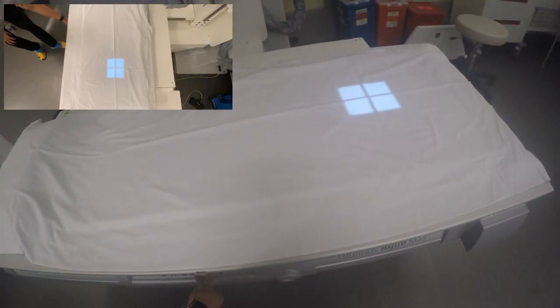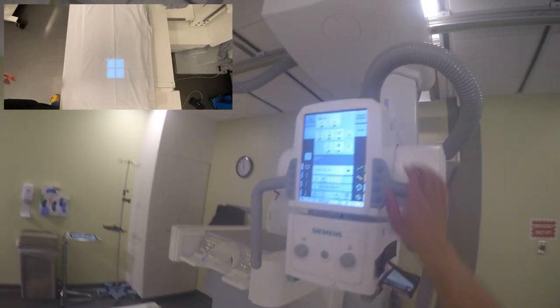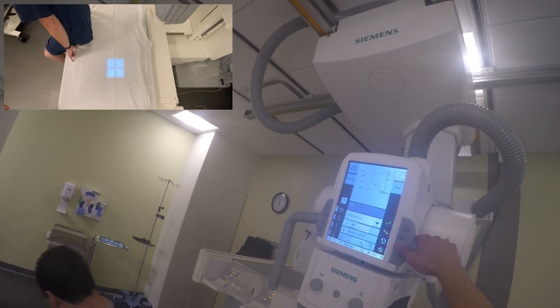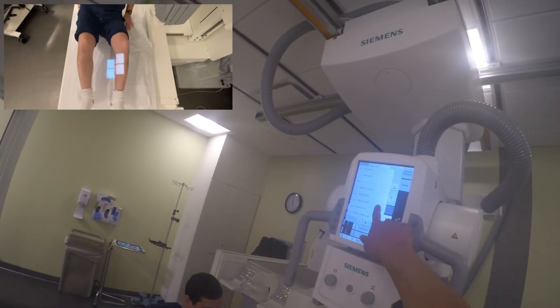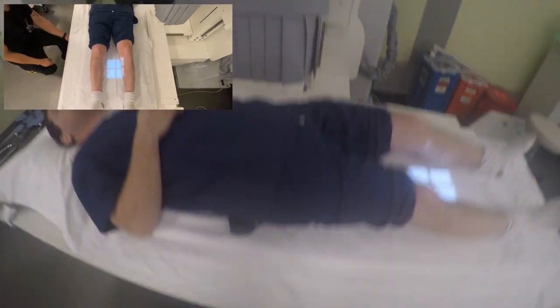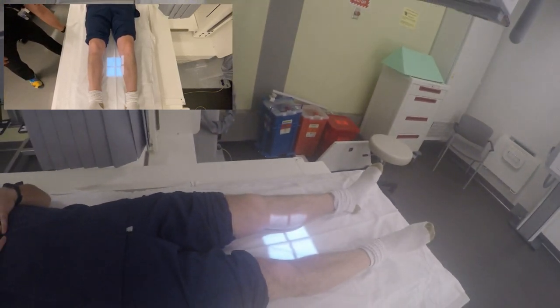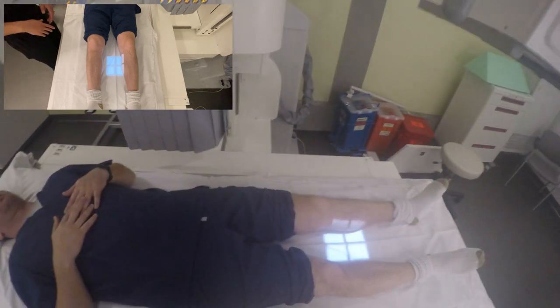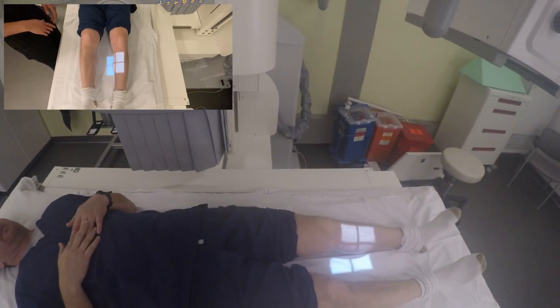Let's go ahead and have you on your back here, please — head on the pillow. We're going to start off with your left knee. I'm going to lift the table up here, okay — just don't be alarmed. Slide over towards me just a little bit. Now scoot your hips — there you go.